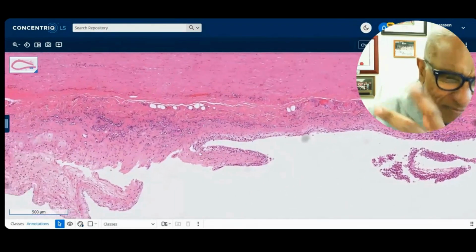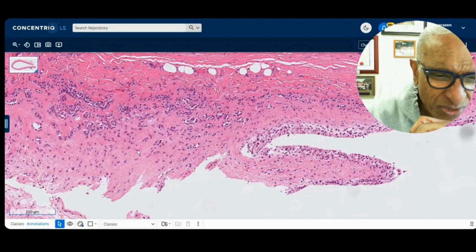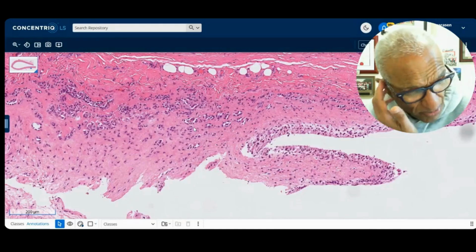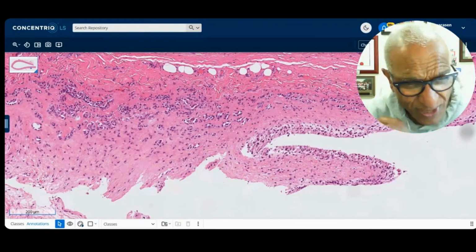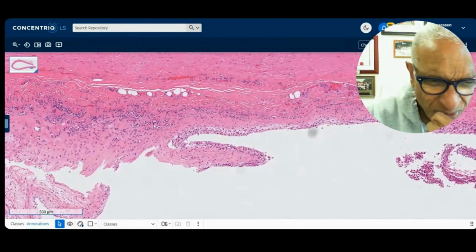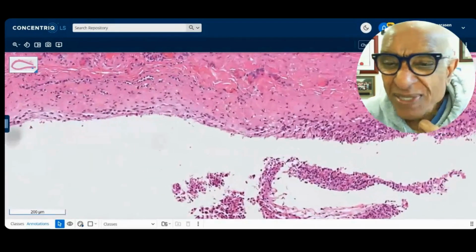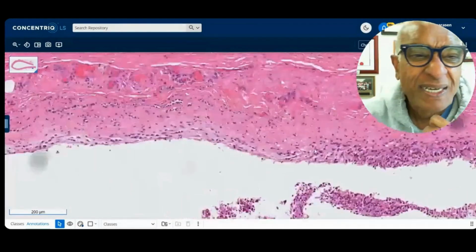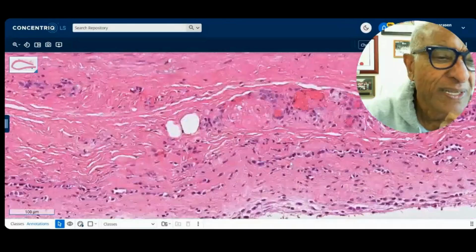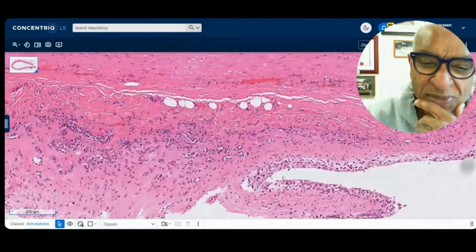And I'm really, truly appreciative of your differentials and your contributions, because recognizing these is useful. I've probably seen maybe 2-3 outside the heart and maybe 2-3 inside the heart. And all you have to do and resort to are your mesothelial markers and your histiocyte markers. All of these here were histiocytic. Not too much. Maybe here's some clusters there as well. I think it's probably just a reactive phenomenon. I don't have any explanation.